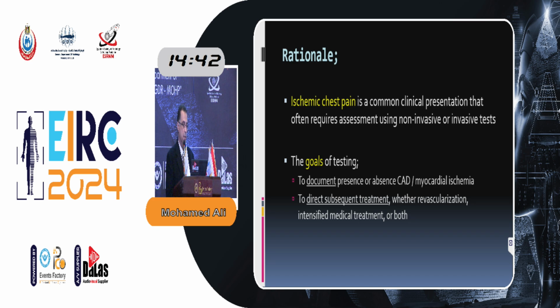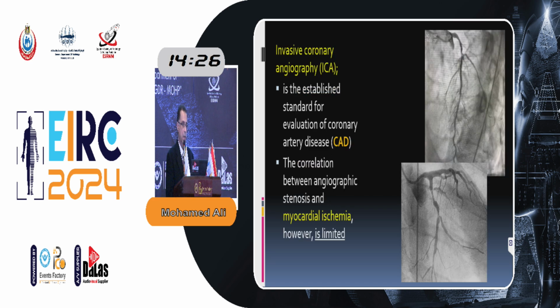Ischemic chest pain is a common clinical presentation that often requires assessment using non-invasive and invasive tests. The goal of testing is to document the presence or absence of coronary artery disease and myocardial ischemia, and to direct subsequent treatment. Invasive coronary angiography is the established standard for evaluation of coronary artery disease. However, the correlation between the angiographic stenosis and the myocardial ischemia is limited.